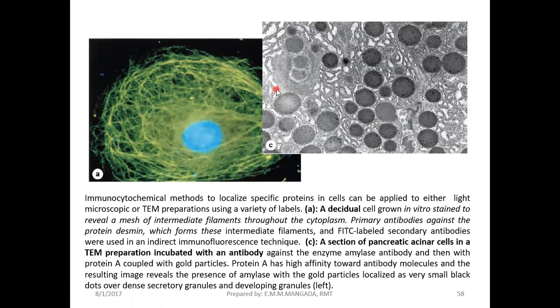Okay? So, yeah. Next. Okay, so guys, we have here an application. Kamukha lang ito guys kanina nung fluorescence assay ninyo. Ito din siya, oh. It's using then fluorochrome. So it's FITC labeled. Kung mapapansin nyo, we have this apple green color here. Okay, so this is an immunocytochemical method. Immunocyto naman to because we are actually using the cell. Okay, so cell yung application natin.